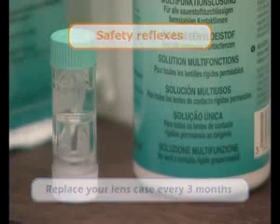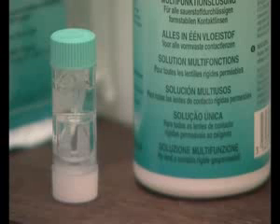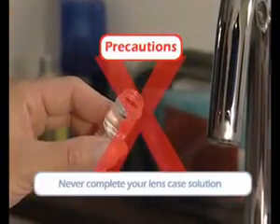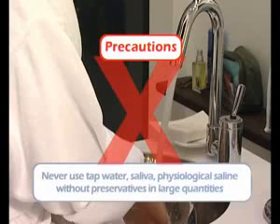Disregarding any advice or hygiene regimens could lead to undesirable side effects and risk of serious ocular infection. Never add new solution to remaining solution in your lens case. Never use tap water, saliva, or physiological saline in large quantities without preservatives to rinse and preserve your lenses.